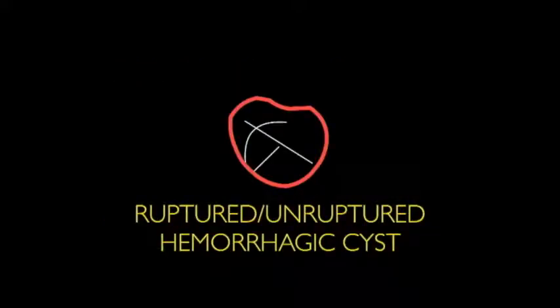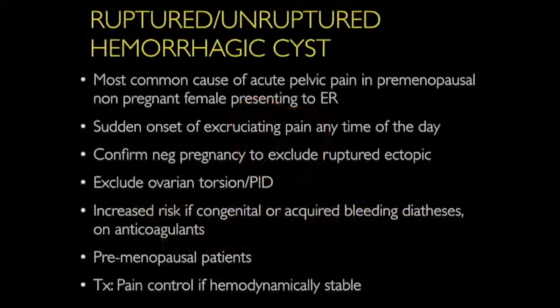We're going to start out with the ruptured or unruptured hemorrhagic cyst. Usually they have a very characteristic appearance and also a very characteristic history. It's also the most common cause of acute pelvic pain in a premenopausal, non-pregnant female presenting to the emergency room. That makes sense because women ovulate, and it's common to get ovulatory follicles and corpus luteums that hemorrhage. It's a very physiologic process.